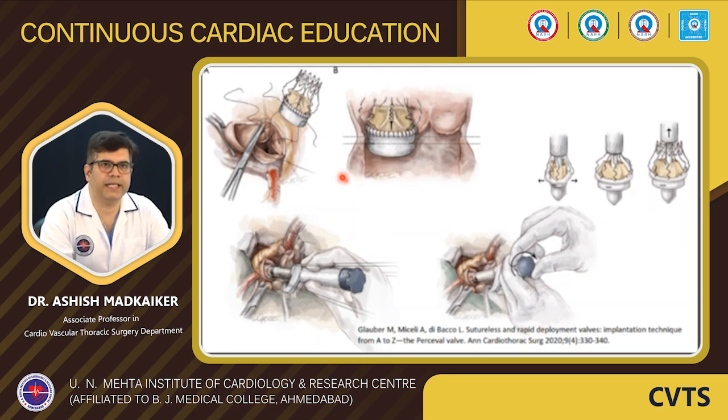The second important advantage for a surgeon is that we don't have to take stitches and tie. It can make placement of these valves in minimally invasive surgeries a bit simpler as compared to a conventional valve. Also, it will save some time in these procedures. At the same time, if we compare this with the TAVI valves, which are also rapidly deploying valves, the advantage of doing a sutureless valve by open technique is that we can thoroughly debride the annulus and place the valve in the best position. So it might give a little upper edge over TAVI when we do a sutureless valve by open technique.